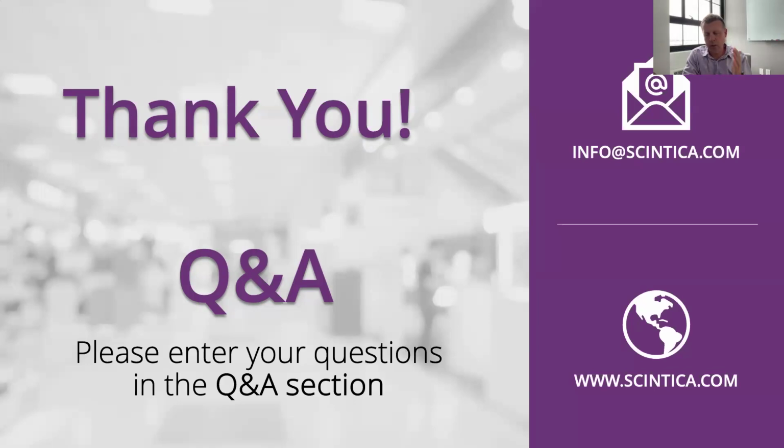You have typically relatively low administered activities and relatively low abundance. So your images are going to improve with counts, because we have Poisson statistics here. So the more counts, the better your images will look. So we're relatively count starved. And then for those higher energies, you are going to have increased scatter, increased septal penetration. There are just a number of factors at play here.